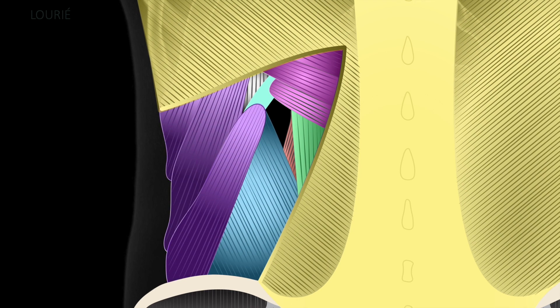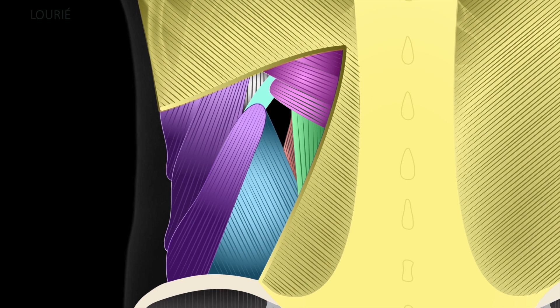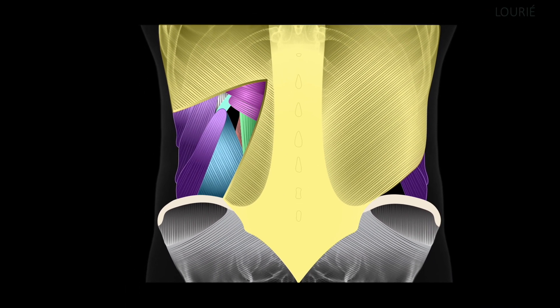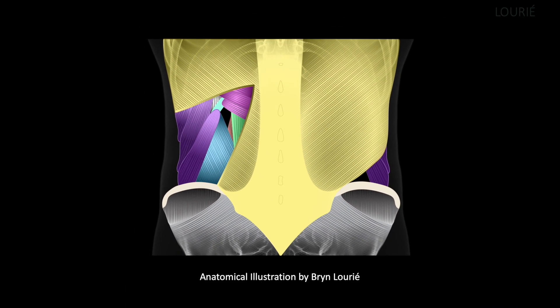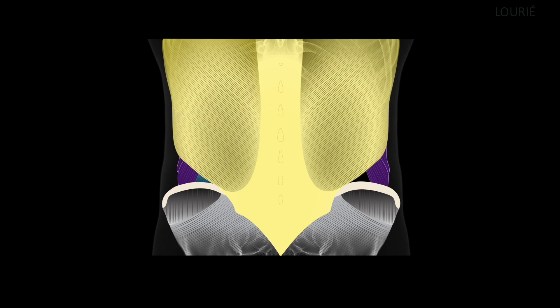It's important to remember that the superior lumbar hernia is not a full thickness hernia. Like a Spiegelian hernia anteriorly, it has a roof or covering — in this case, the latissimus dorsi over it.